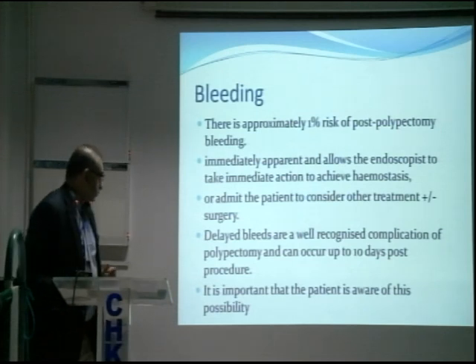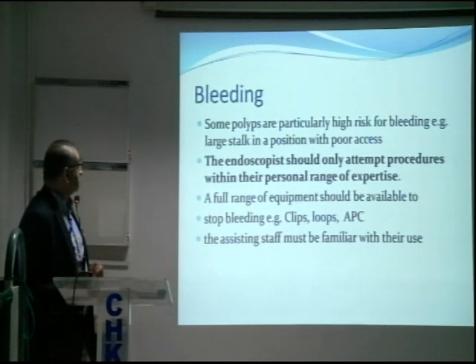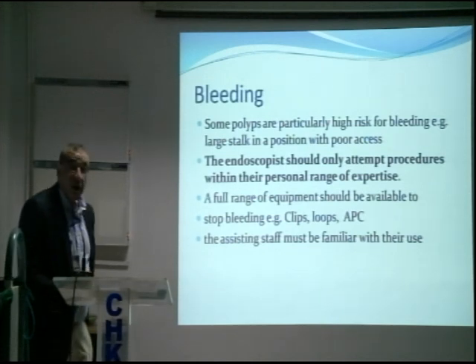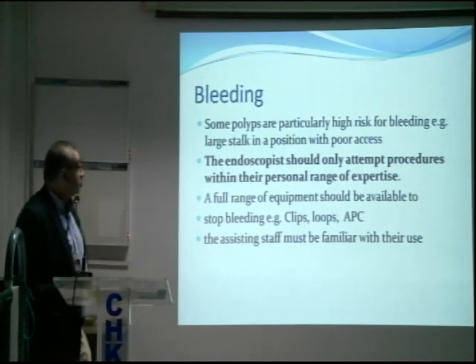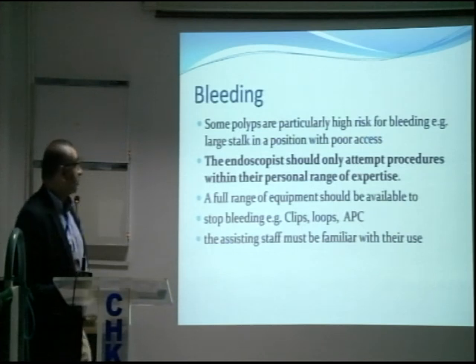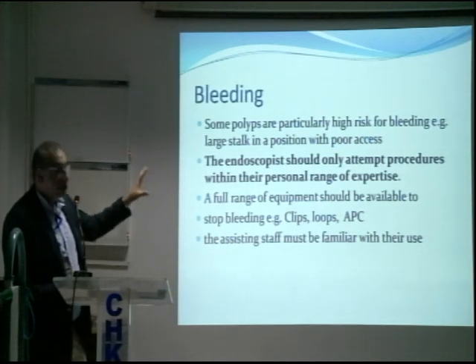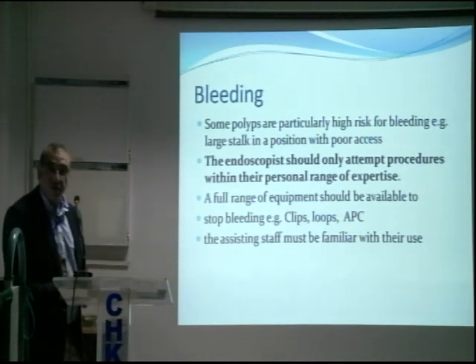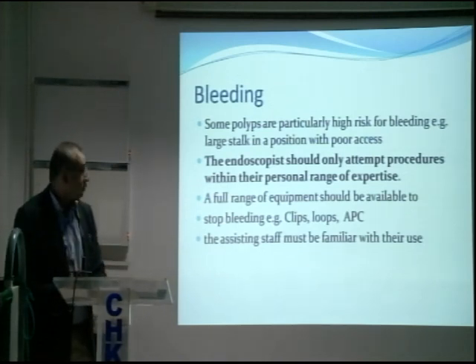Now, when you do polypectomy or EMR, you should be aware of the risks, and that should be conveyed to the patient. As I mentioned earlier, you should be prepared. You should only do it if you are able to do it, if you've done it before. Not that you've seen a video of it and try and do it yourself. That shouldn't happen.